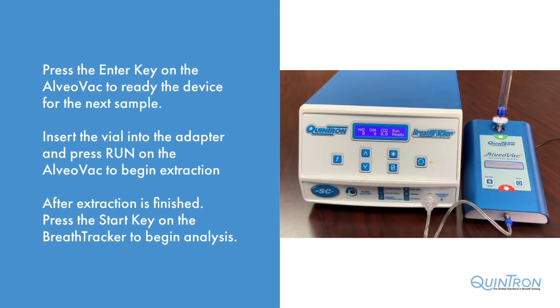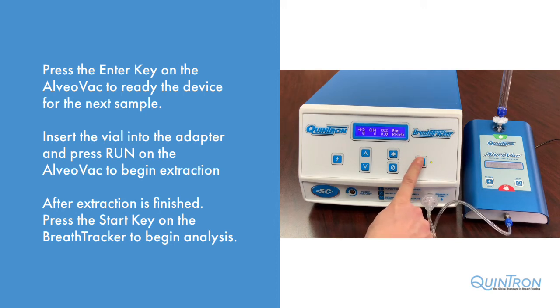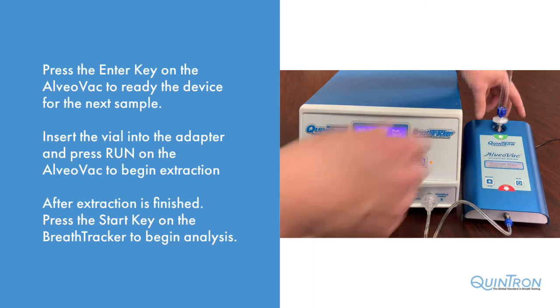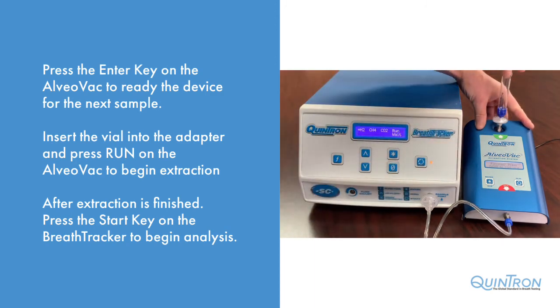When the extraction is finished, press the Start key on the Breath Tracker to begin analysis. You will continue this process until all of your samples have been finished.